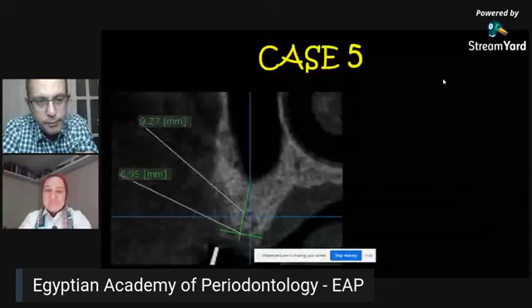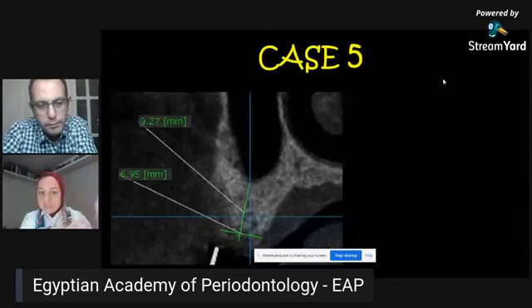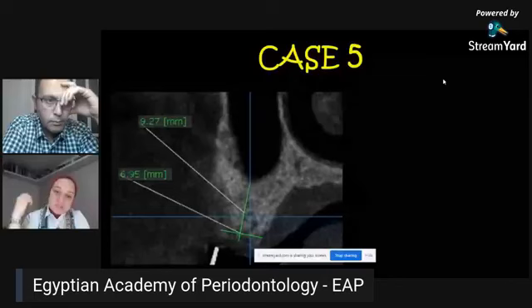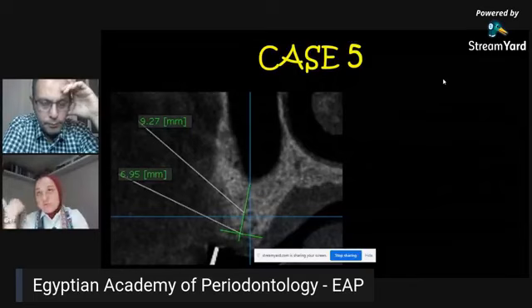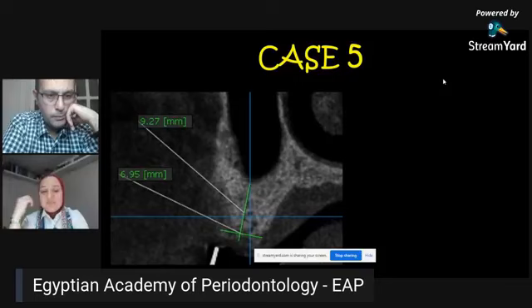Okay. So cases number 5 and 6 addressed the deficiency with height of the bone. We talked about thin ridges and horizontal deficiencies, and now we are going to address vertical deficiencies. What if you don't have enough height of bone, especially in the posterior area where you have the maxillary sinus pneumatization? Of course, in the lower posterior it's more challenging, and you can go for short implants, but short implants in the upper posterior is really still an area of research. So sinus lifting, either internal or external, as we're going to address, is still an option of treatment. It's still on the table.